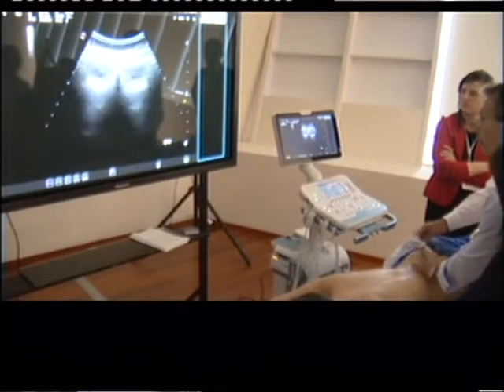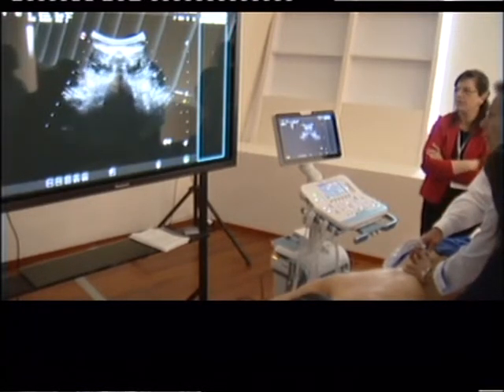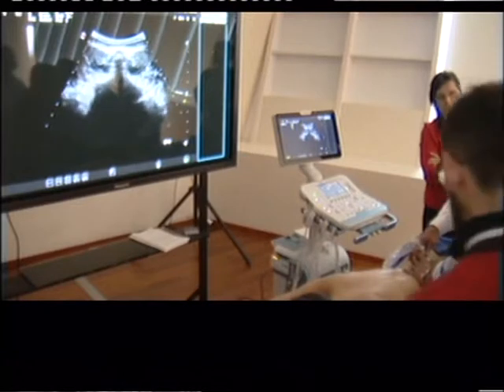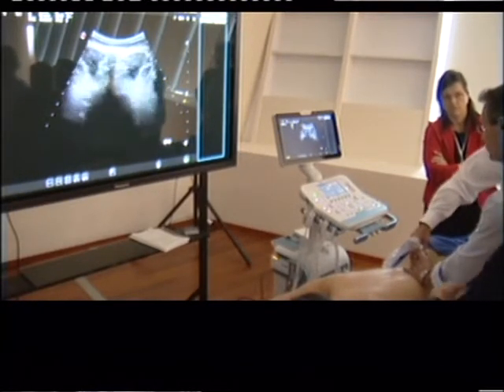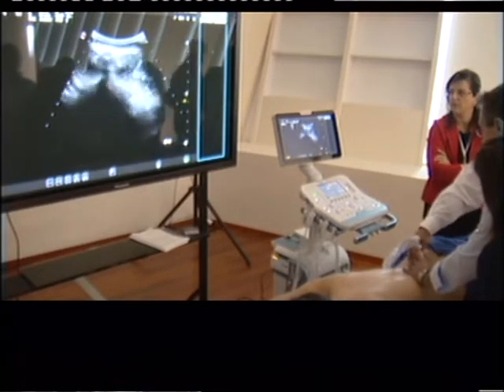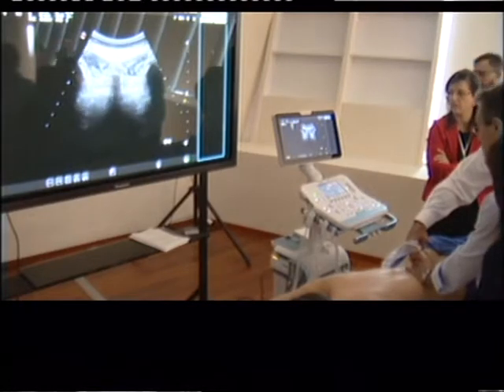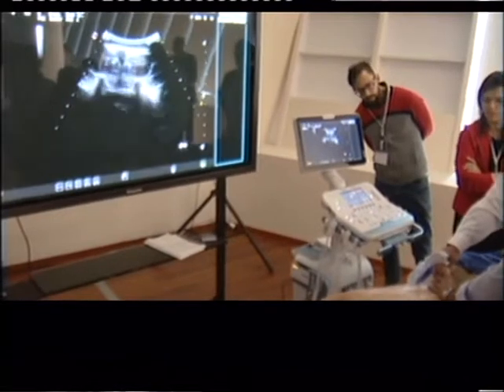So remember, now look, here's L3. That will be, when you'll be down then, straight down. But here, look, there. No, don't look up there, look here. L3. No, look here, don't look there. 3, 5, sacrum. 5, 3.